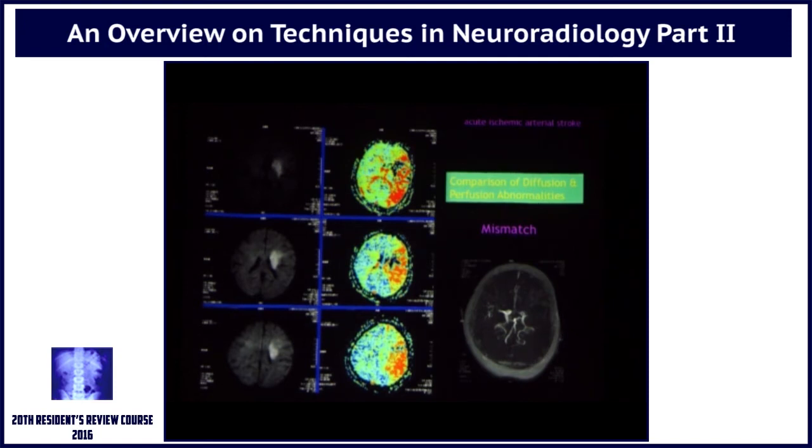By offering IV thrombolysis or endovascular clot retrieval, this cannot be retrieved. But the images in the right column, the perfusion, show you a red area of ischemic tissue, which is bigger than the infarcted core. And this can be salvaged if reperfusion is offered.